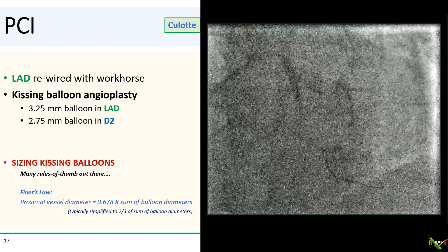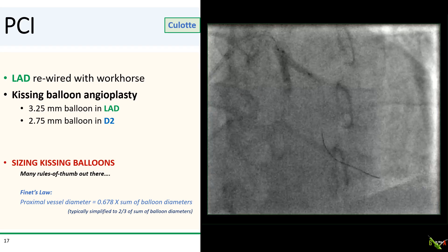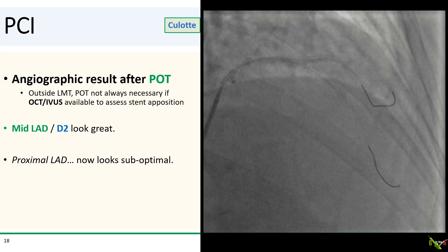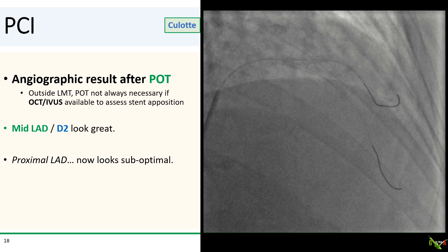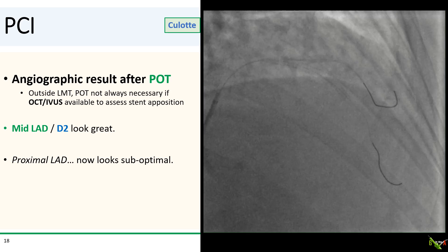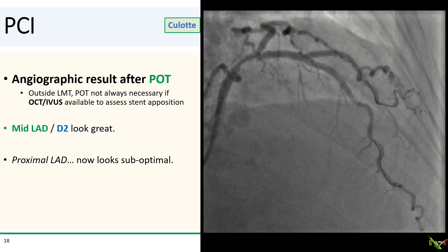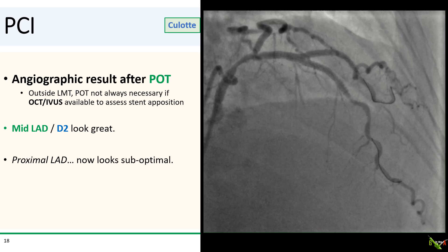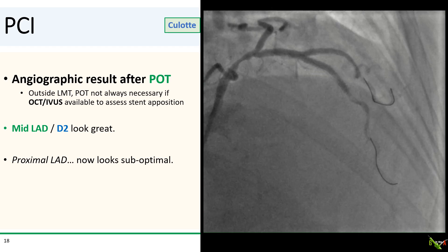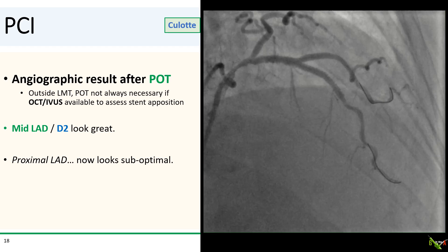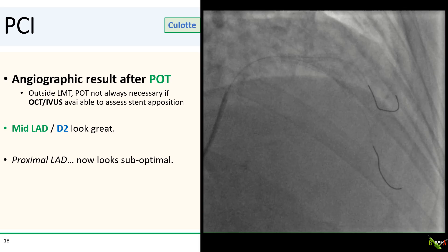In our case, we thought that the proximal vessel was about 4.0 mm in diameter, which is two-thirds of six, which is the sum of 3.25 and 2.75. Here is the angiographic result after POT. POT is recommended to make sure that the stent segment is well expanded and apposed to the vessel wall proximally, but I don't think it's always necessary if you have OCT or IVUS available to assess stent apposition. The mid-LAD and D2 look pretty good, but the proximal LAD looks a little bit suboptimal.